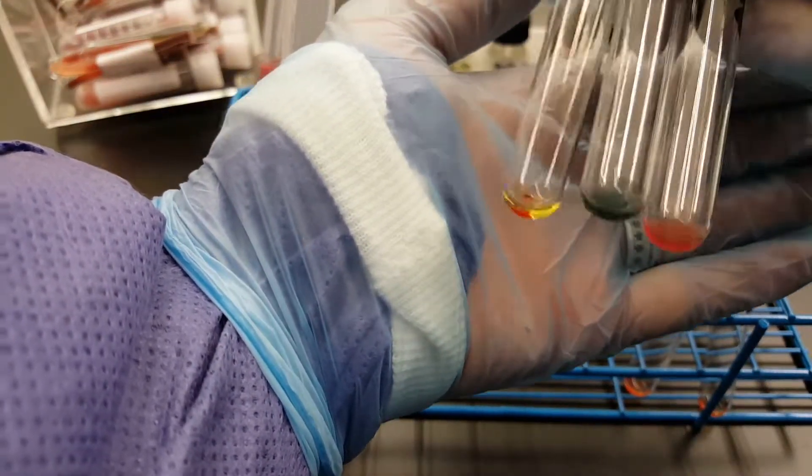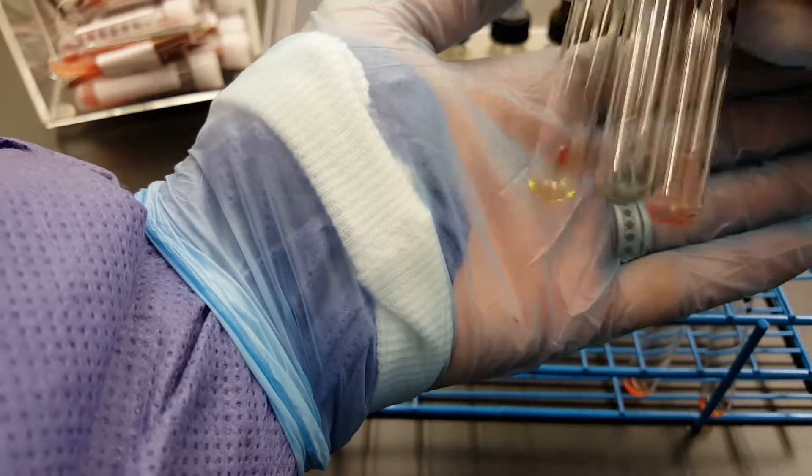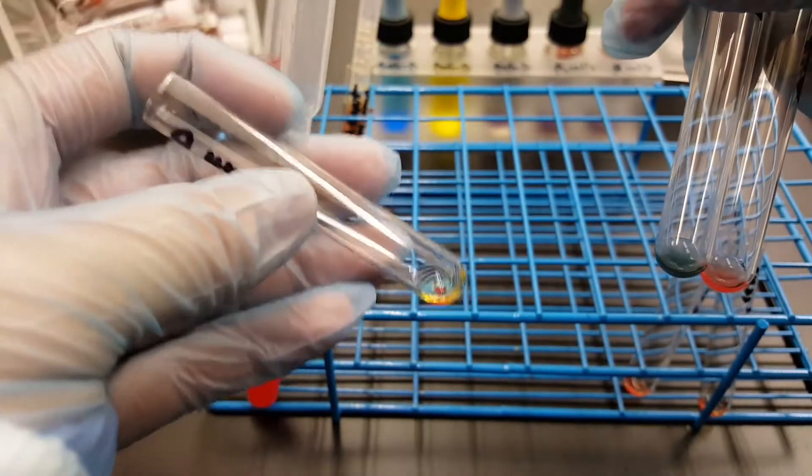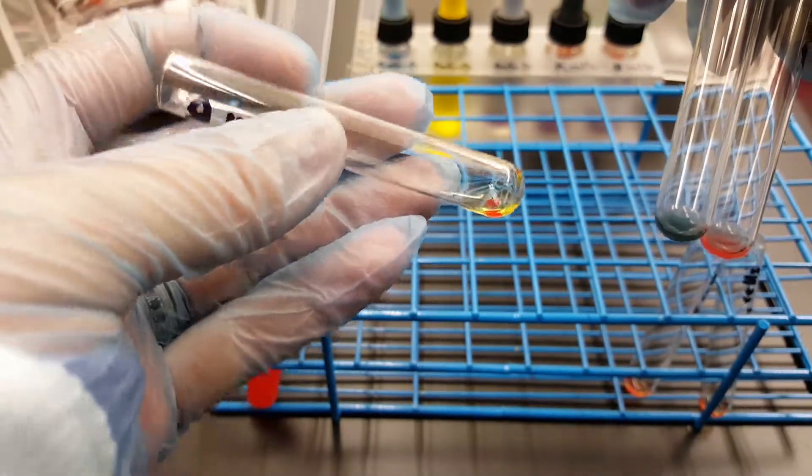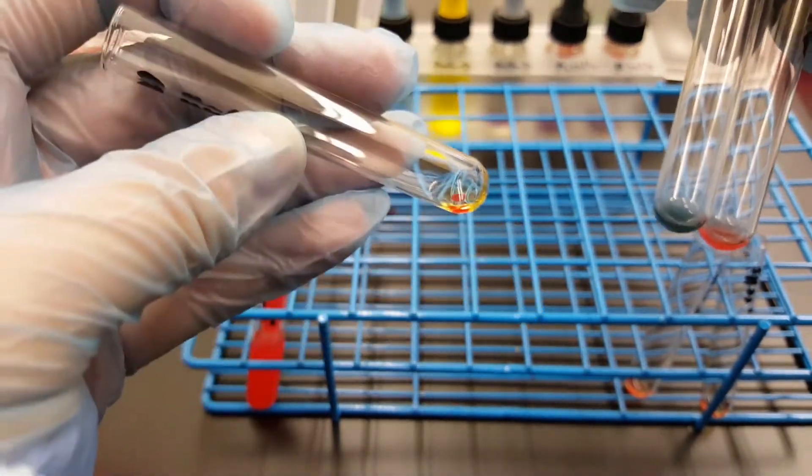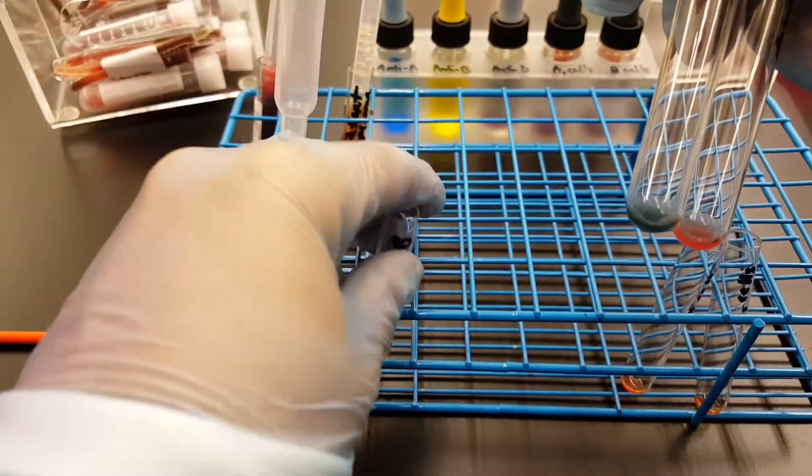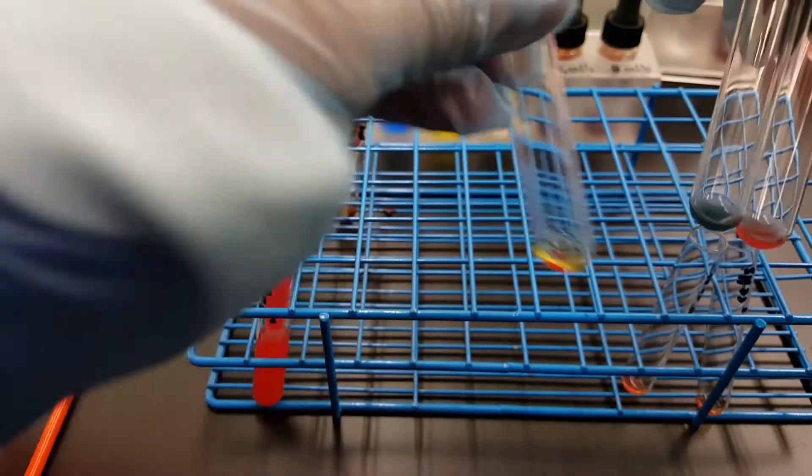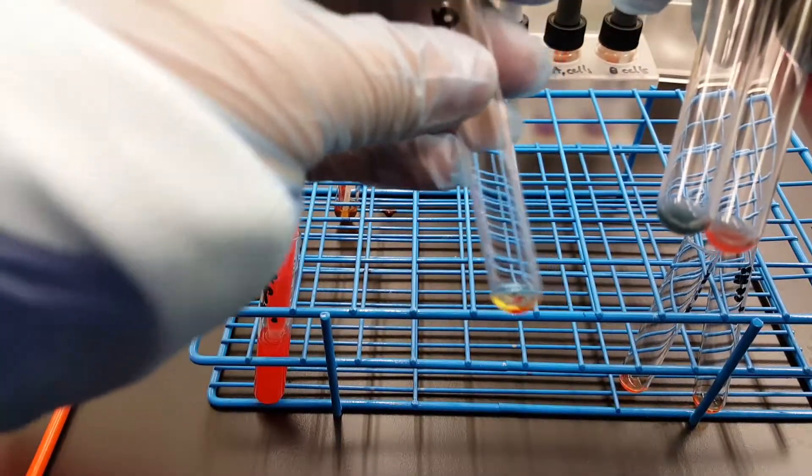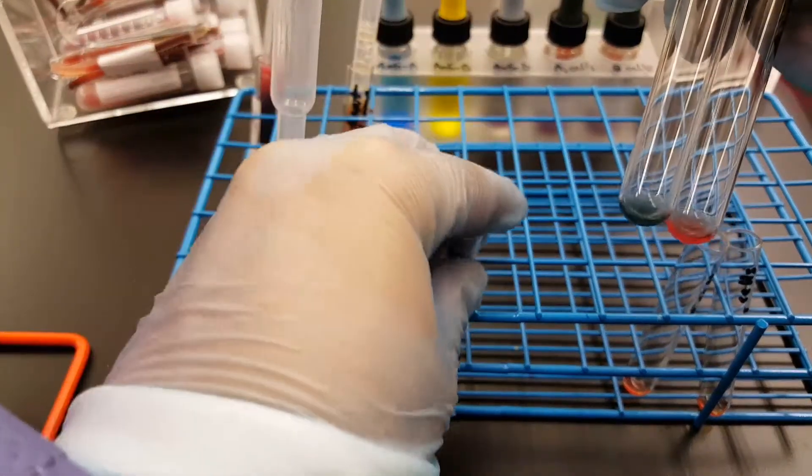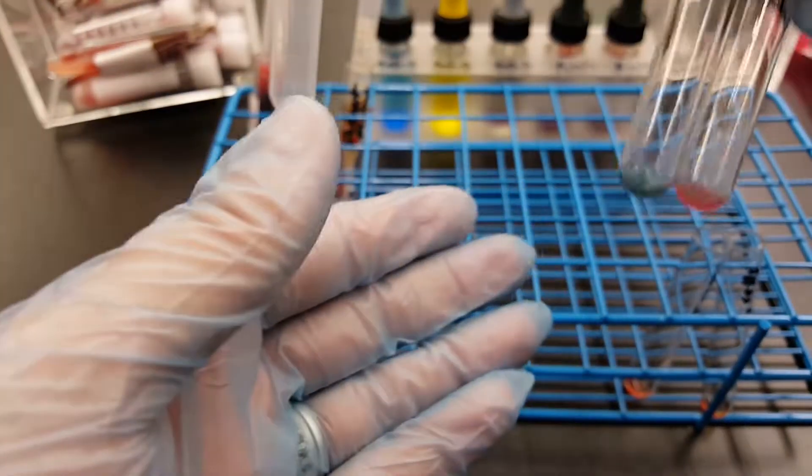And if you'll notice, the A is continuing to have a really big button, so we're going to think that this person is A... I'm sorry, that's B. The B is very prominent and so we're thinking that the reaction is going to be B something, because it doesn't look like the A has any agglutination at all.